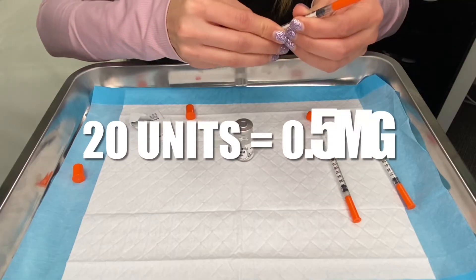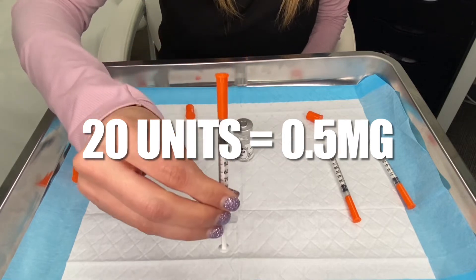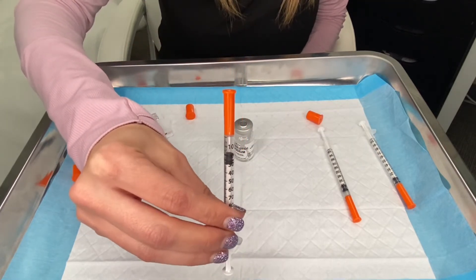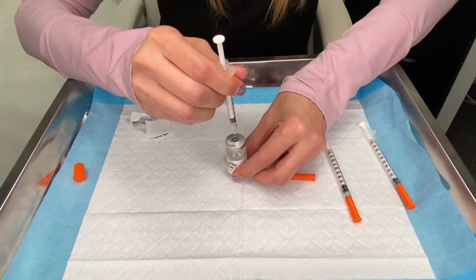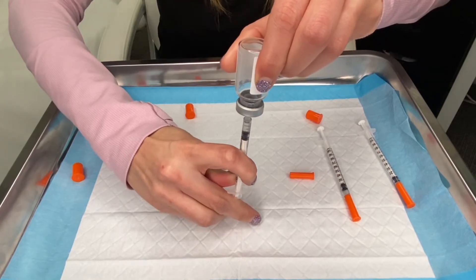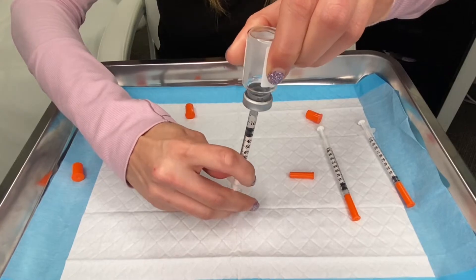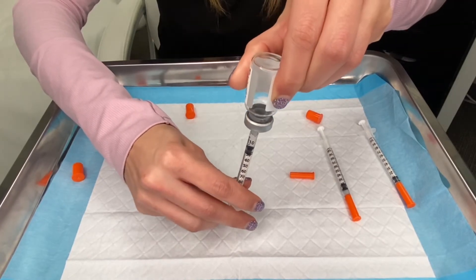For month two, the dose is 0.5 milligrams, which is at the 20 unit line — that's the weekly dose for month two. Same as before, you're going to inject air into the vial and pull down on the plunger until you get to the 20 unit line, so twice as much as the last dose. 20 units is the 0.5 milligram dose.